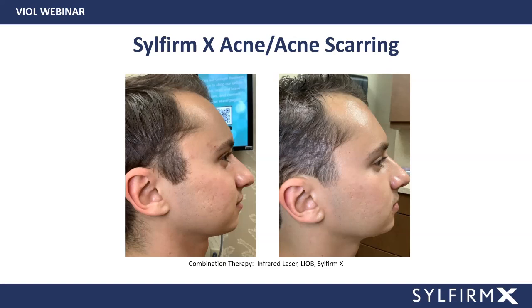And it's interesting, as I look at the photos on him, because we were working just beyond the basement membrane zone, I was in the range of about 0.5 millimeters deep with him. We were able to get some reduction in some of the redness that he has. Redness in the cheeks and through here is reduced. Some of the brown pigmentation in the scars is reduced as well. And we were able to significantly reduce the number of scars that he has, and we were able to reduce how each scar itself responded. So the scars weren't as deep, they were more superficial. Some of the really superficial scars, if you look towards the mouth area, are basically gone. So some of the scars are eliminated if they're superficial. If they're deeper, they become more superficial. We're able to reduce some of the discoloration associated with them and some of the redness with them. So it made Mom very happy.